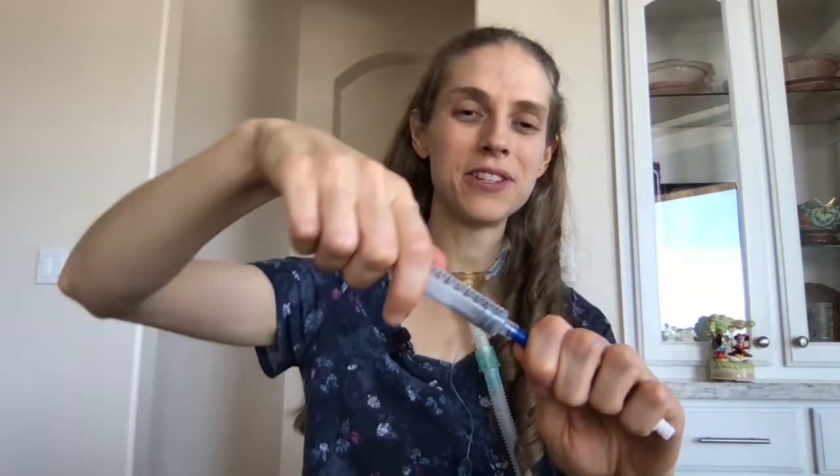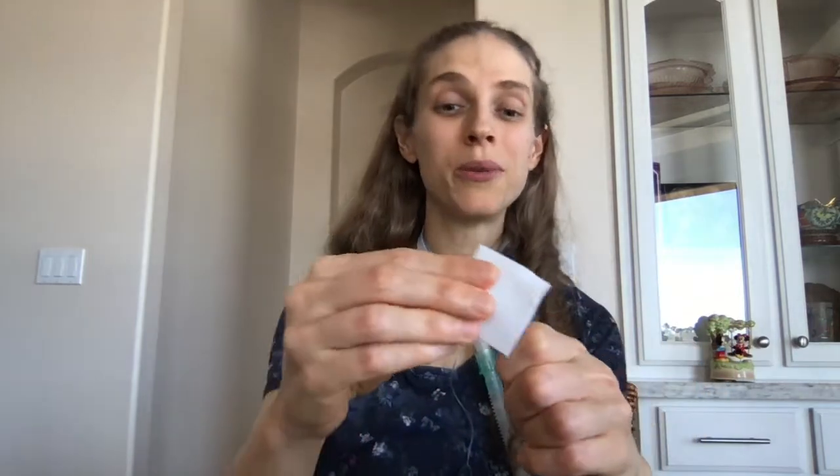Once the saline is all infused, disconnect by twisting off and putting the cap back on — you can discard the used flush. Now disinfect the top of the line again: open another alcohol swab using your fingers, and scrub the end for approximately 15 to 20 seconds.